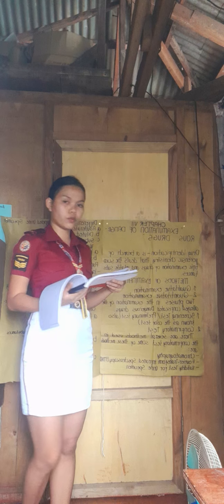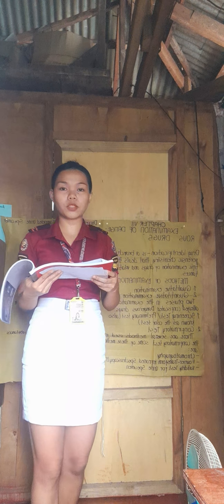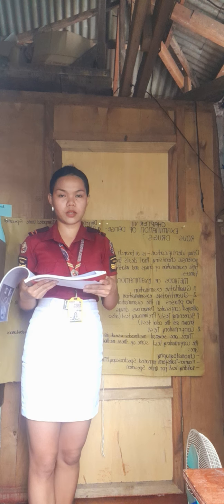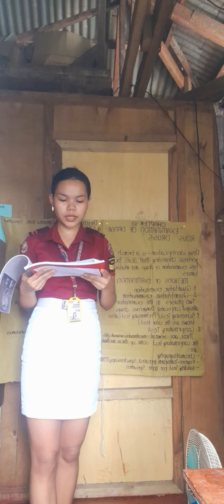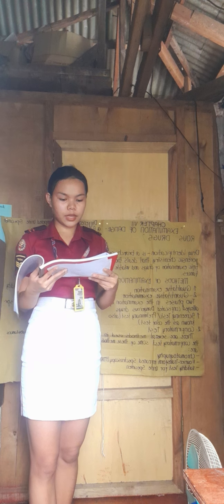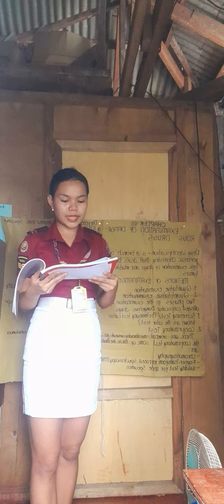So let's move on to the two phases. But before that, there are steps common to qualitative and quantitative methods. There are 8 steps. First is selection of methods to be used. Second, physical test. Third, sampling. Fourth, sample preparation. Fifth, chemical test. Sixth, confirmatory examination. Seventh, calculation and interpretation of data. And last, drawing of conclusion and writing report.